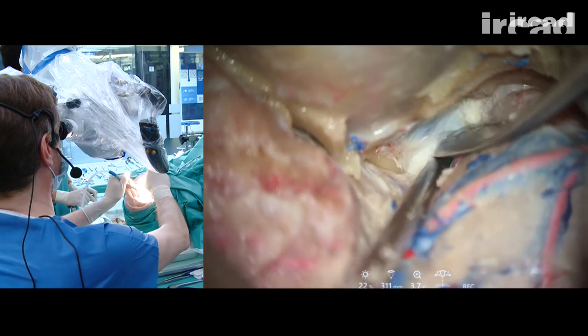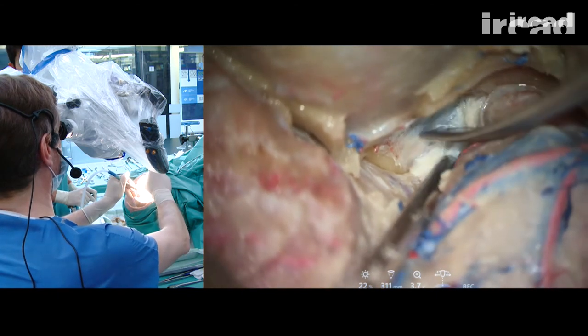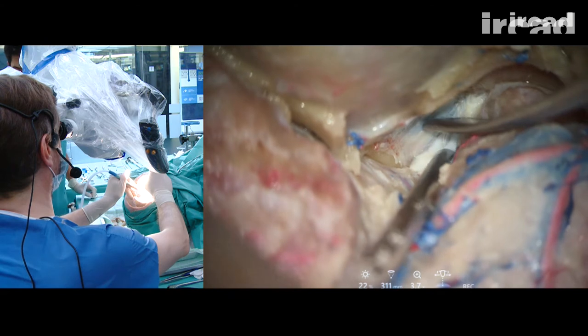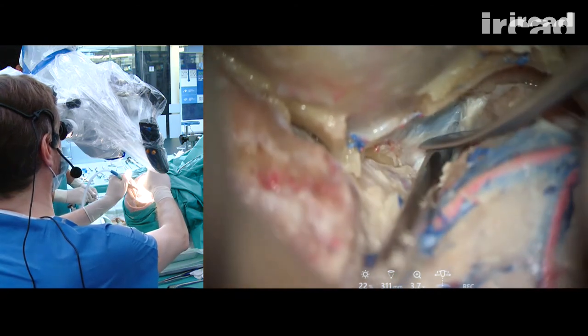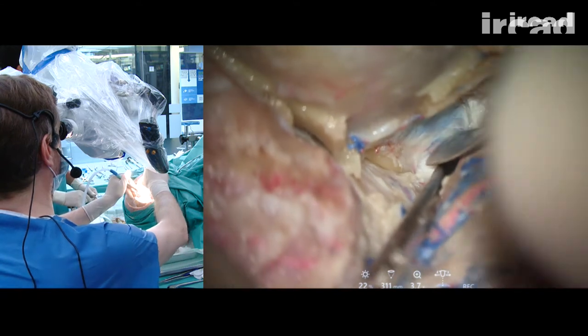So I can keep this peeling as far back as I want. What I see here is a superior ophthalmic vein. This could be V1 here. Difficult to say.